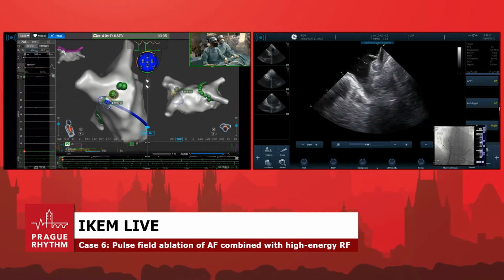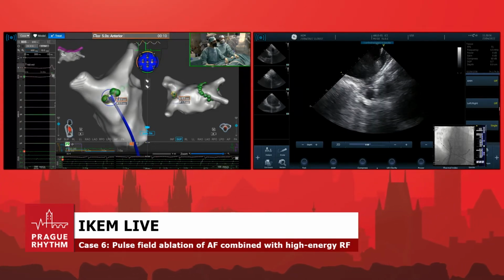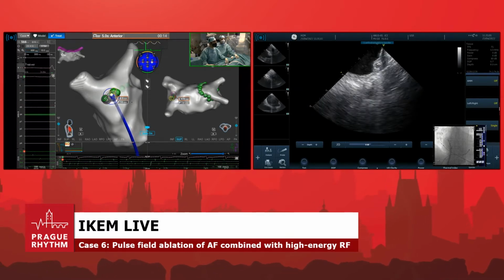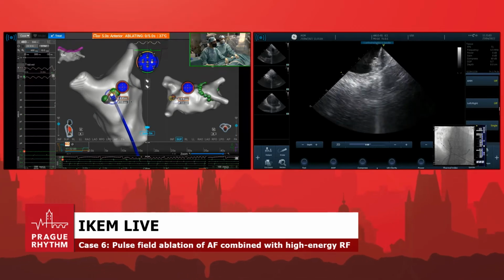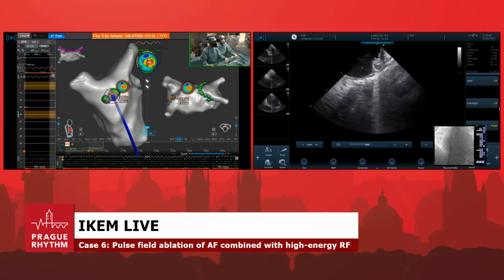You know what, guys? I'm going to show you just an RF lesion. Joseph, can you hear us? Yes. So I switch now to an RF lesion, and the RF lesion is going to be 5 seconds, and you can see the heating on the center of this catheter, the bullseye around D3.